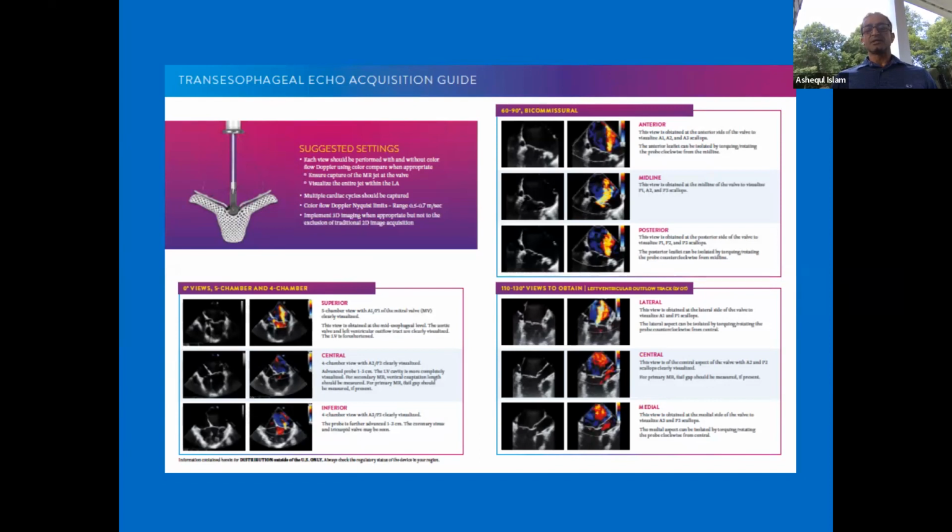I'm not an echocardiographer, so I would not pretend to be very good at it. I actually have not done a TEE since I finished my fellowship. But I had to relearn what I'm looking at, what my colleague is telling me, and what I'm telling them to show me, because of the mitral clip procedures. I had to relearn it again.